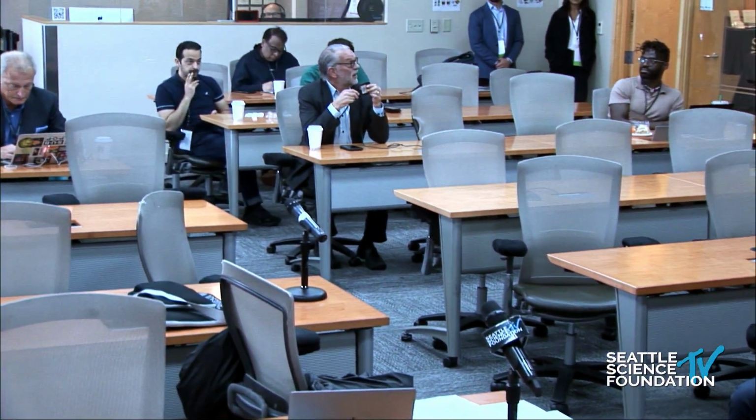Any other questions? Bob? Is this working? Yeah, I guess it is. So great talk. I think you hit on a lot of the primary issues, and I totally agree. There's this conflict between stiffness. We need a stiffer rod for healing, but the trade-off is junctional problems as a result.